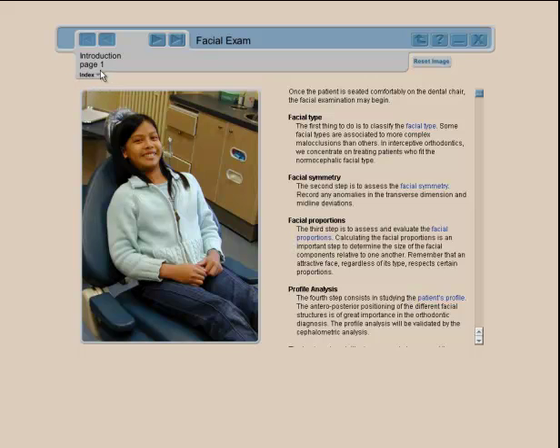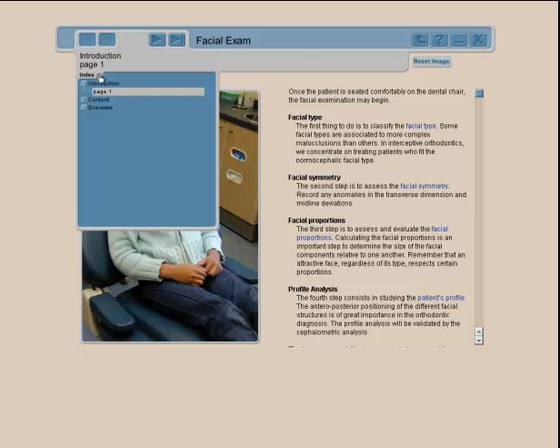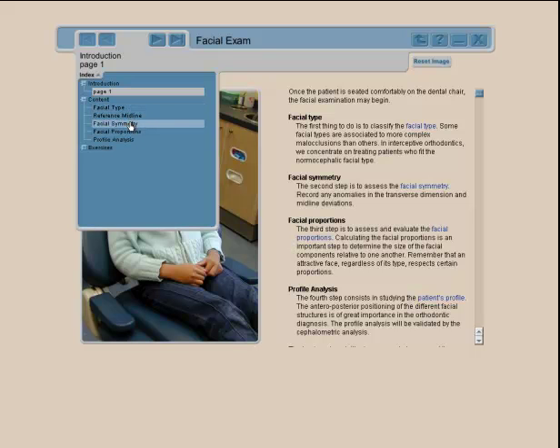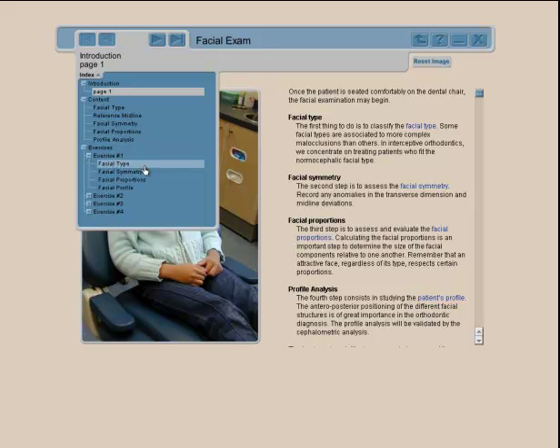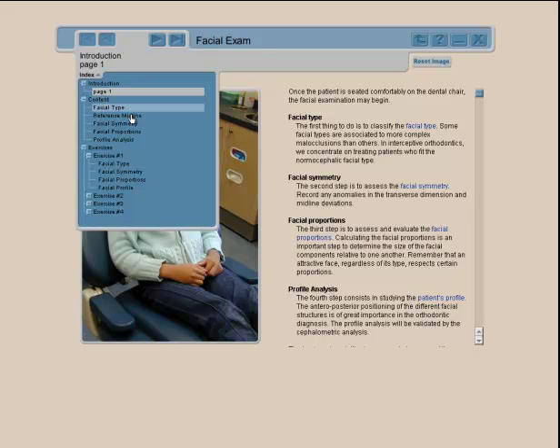On the left-hand side you'll notice the index, which has content divided into subcategories describing facial type, reference midline, symmetry, proportion analysis. Once you finish with the sub-modules you can do an exercise covering facial type, symmetry, proportions, and profile. Every content sub-module is matched with an exercise.